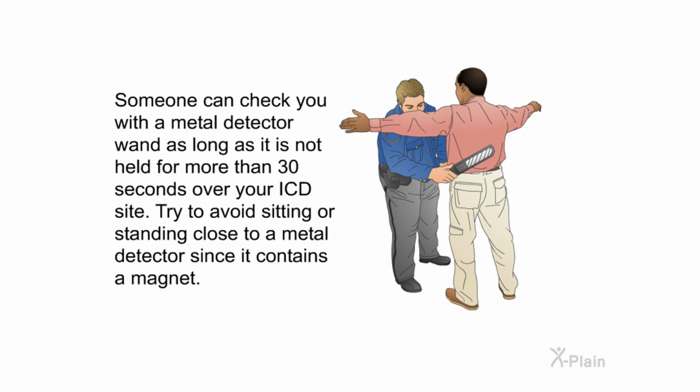Someone can check you with a metal detector wand as long as it is not held for more than 30 seconds over your ICD site. Try to avoid sitting or standing close to a metal detector since it contains a magnet.